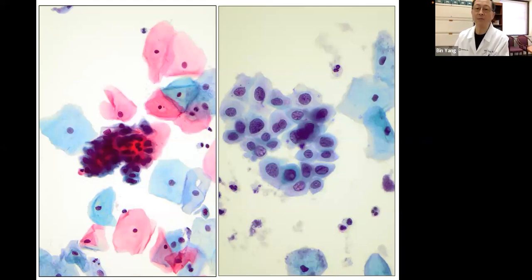Is this part of the spectrum or is it already into HSIL? So each one individually, you have to take into consideration. But if you look at this, they're very uniform, look clonal, similar size, less variation than LSIL. Still have quite some cytoplasm, but compared to LSIL it is much less.